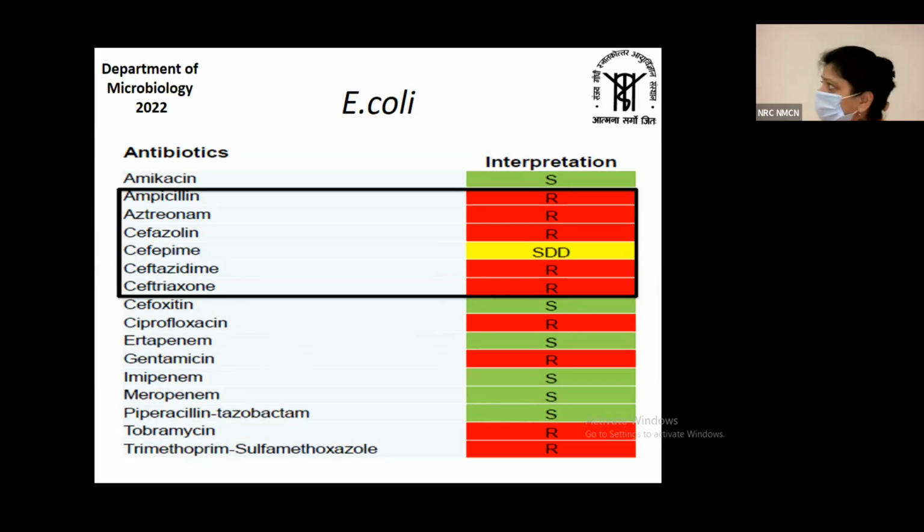So this is how you are supposed to read the antibiogram, and this antibiogram will be true for an E. coli or a Pseudomonas aeruginosa or an Acinetobacter baumannii. By and large, the drugs remain the same, only the activity changes. There are some drugs with anti-pseudomonal activity, but by and large, these are the panel of agents. Maybe colistin is not here, fosfomycin is not here, and this is for a gram-negative isolate. For a gram-positive isolate, it could be Staphylococcus or Enterococcus. Okay.